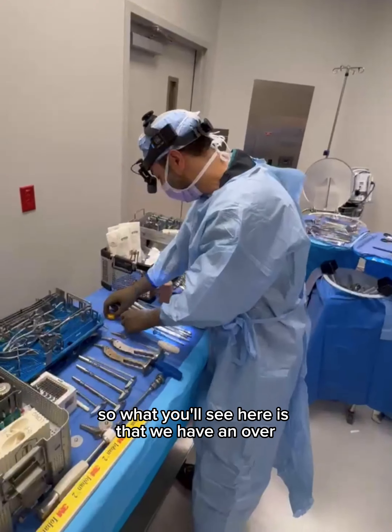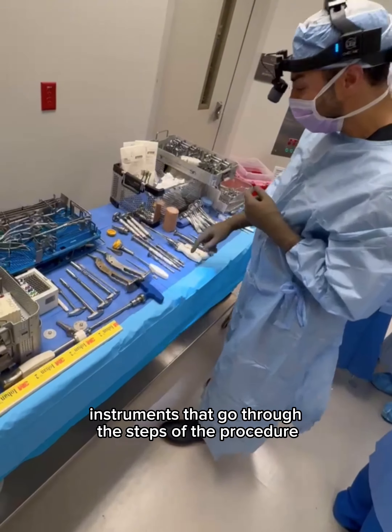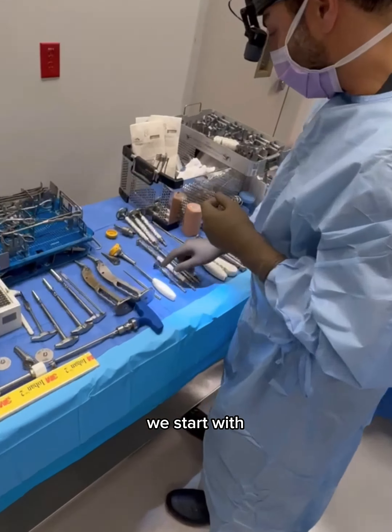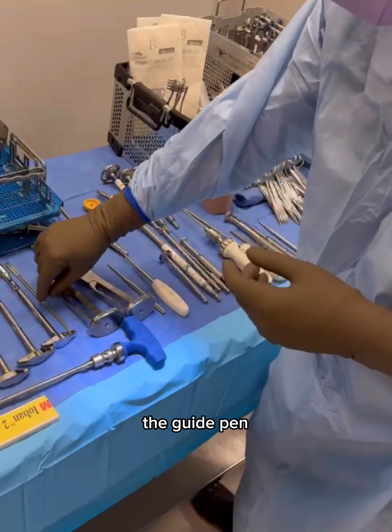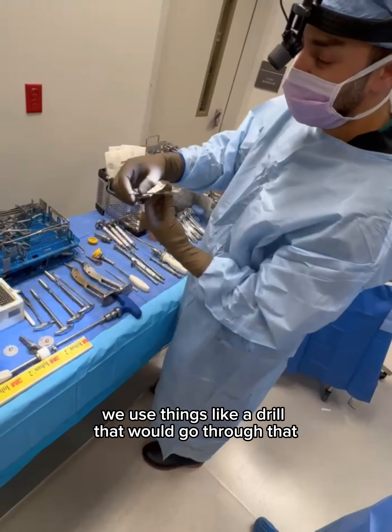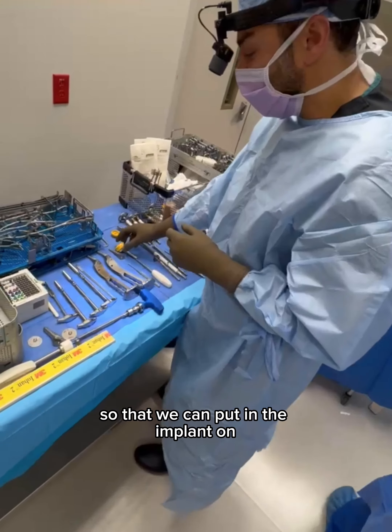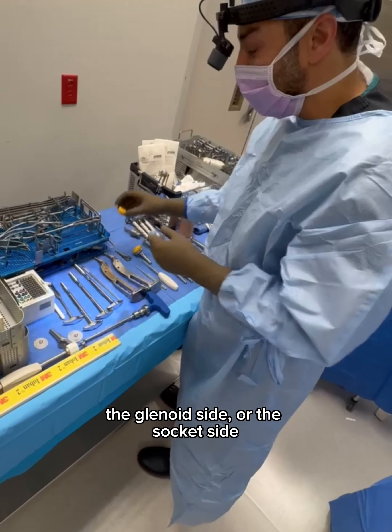What you'll see here is that we have a number of instruments that go through the steps of the procedure. We kind of start with the guide pin — we would take a guide pin and put it into the socket. We use things like a drill that would go through that so that we can put in the implants on the glenoid side, the socket side.